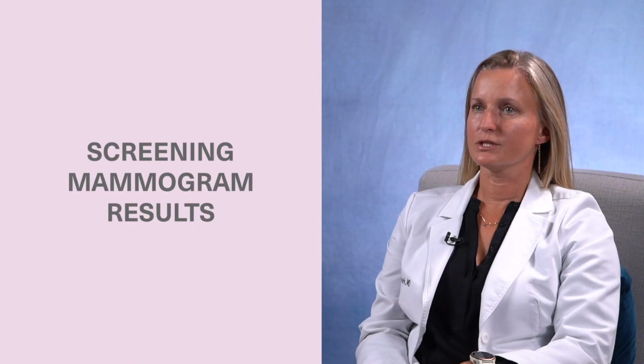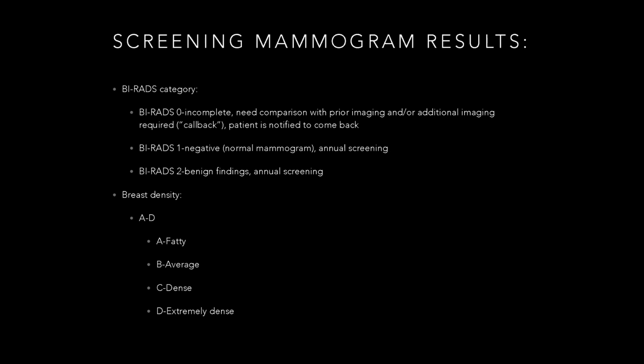Screening mammogram results. These reports should only be a BI-RADS 0, 1, or a 2. 1 and 2 basically come back next year. Mammogram is normal, or if there's a finding there, clearly benign findings.